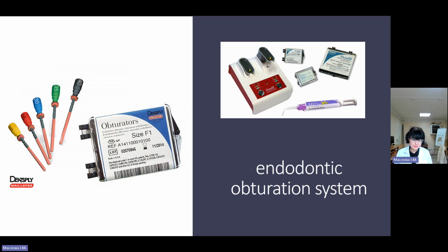Despite many techniques that have been used for three-dimensional obturation of the root canal, the one called lateral condensation of gutta-percha is still the most widely accepted. One main advantage of this technique is the ability to control the length of fill; it is simple and reliable and can be applied to most cases. However, this process is time consuming and has the potential to place a lateral force on canal walls, which leads to vertical root fractures.